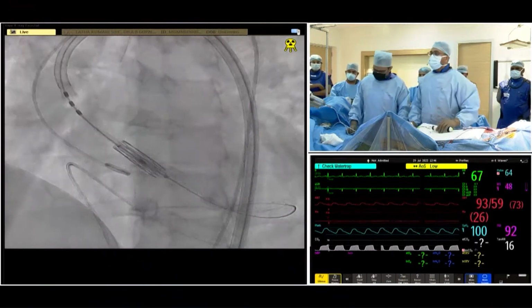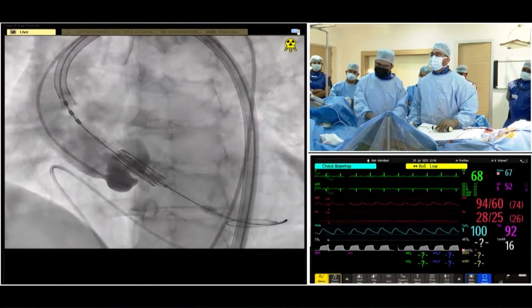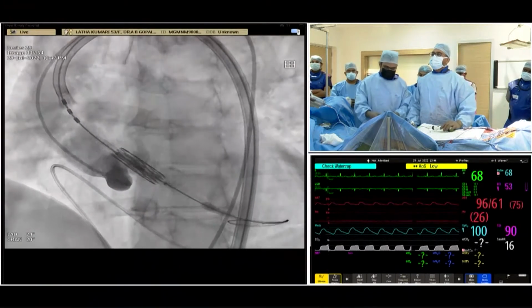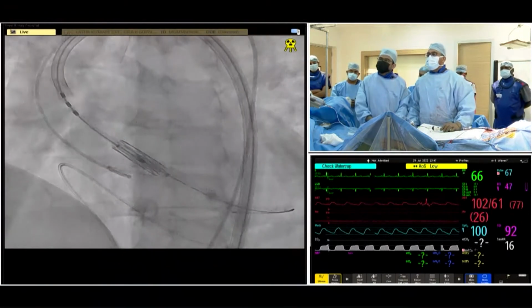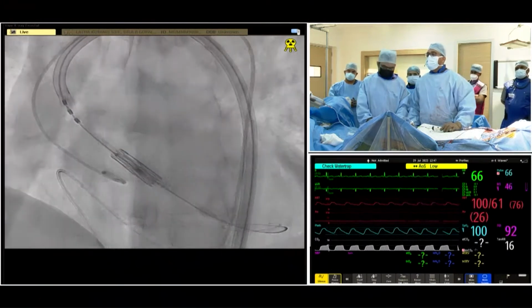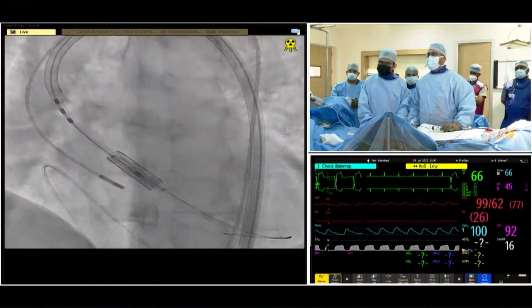All right, guys. Ready for injection, guys? Give me an injection. Inject, ready? Okay, Abu, ready? Little deep, I think, right? Yeah. So I'm just going to come back a bit, but mind you, Ramesh, I'm also bearing in mind I am higher than where I think I am. Because the balloon valve is slightly deeper. Offset. I've borne that in mind.